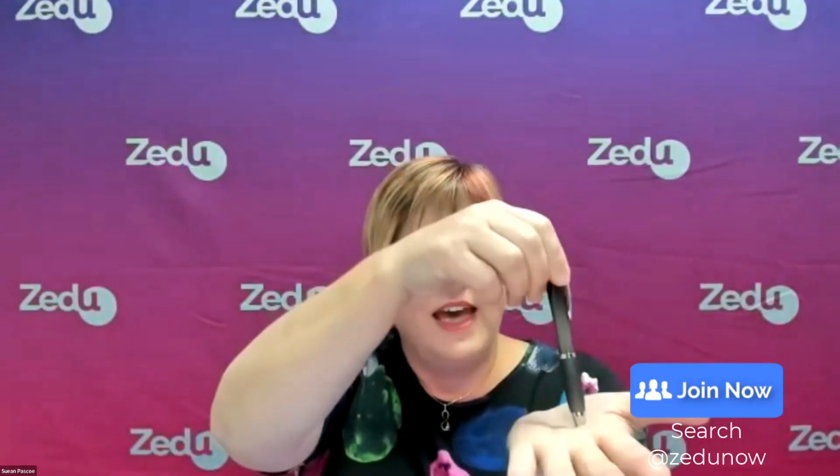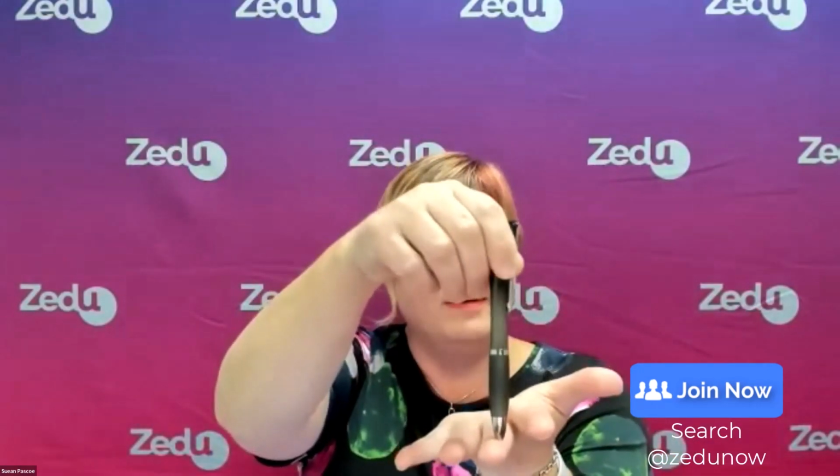Yeah, look, the other thing that I do have on hand is, I don't know if you can see it, yeah, there we are, an empty pen canister. You can put the hand in the water bath and you just dig this in and drill it into the skin on each end of the probe. And then you end up with an indent. I've got a bit of an indent here. So that takes away the problem that you can't mark it underwater. You've just got to find it first.